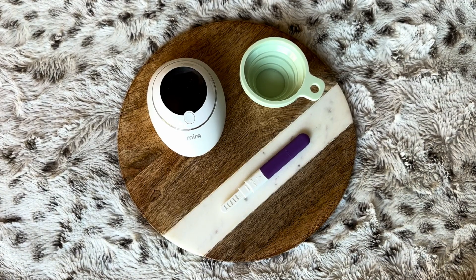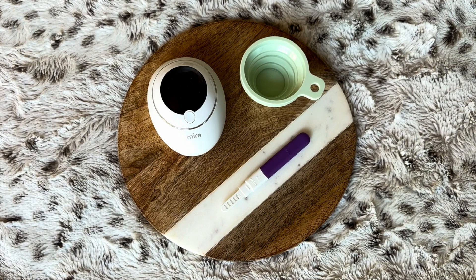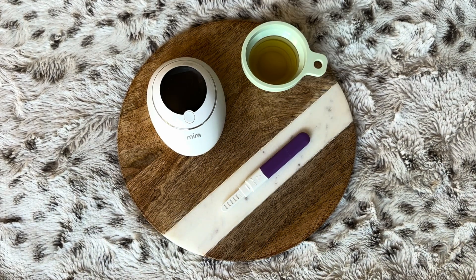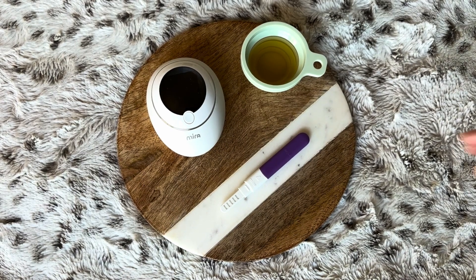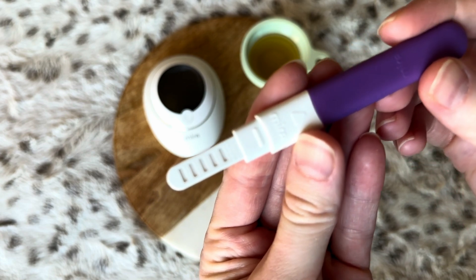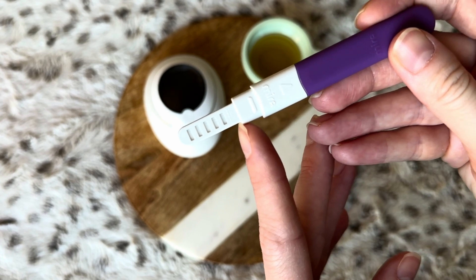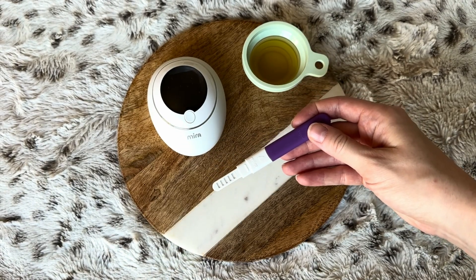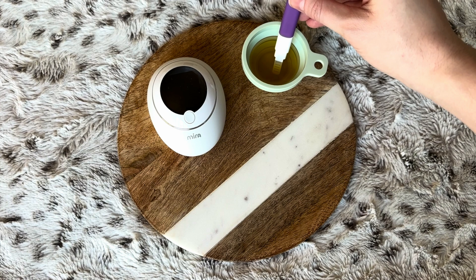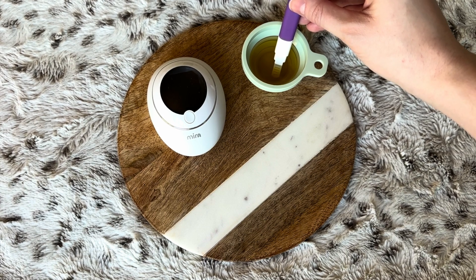Now that we've looked at the Mira analyzer and the wands, let me walk you through step-by-step how to use them. First, collect your urine sample using the reusable silicone cup. Unwrap your test wand and dip it in the collected urine for 10 to 20 seconds, dipping the sampling end in and immersing the wand up to the max line. Mira recommends you use your first morning urine. Remember to clean and dry your urine cup before each test. Do not shake the wand at any point, and do not dip the device reading window into the urine.